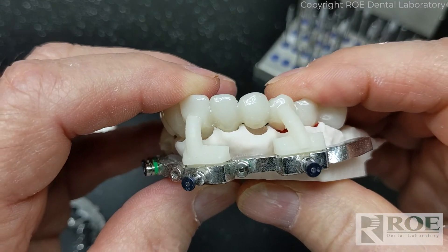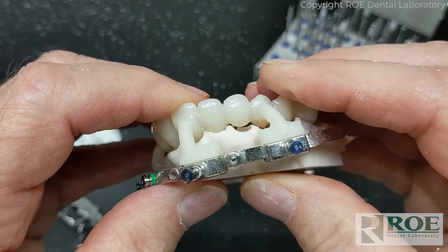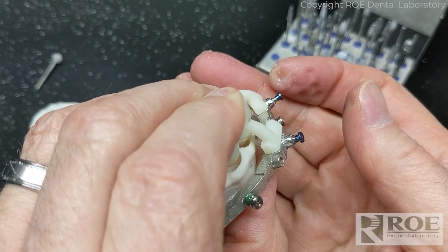The right side of the prosthetic is now seated properly into the fixation base. You can see in the box areas where the Swiss locks are that those are flush, and we can push the pins in and do pickups.